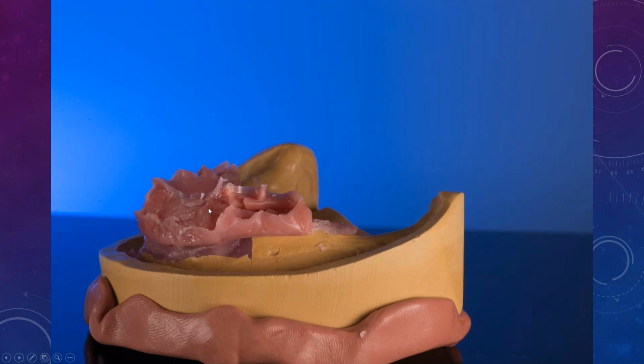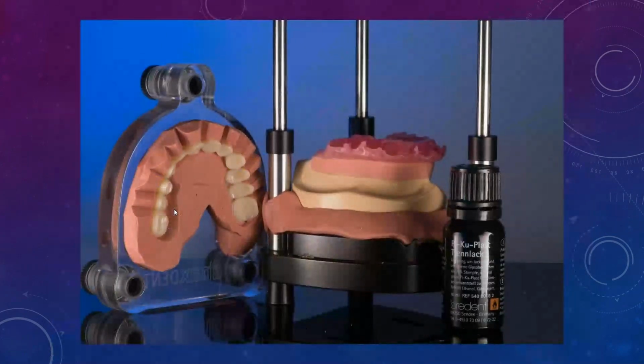But what happened in the beginning when I tried to pull it out, I didn't warm the wax enough, and ended up breaking the wax. If you want to use this method, make sure you get yourself a dehydrator. Put the denture in there, wax-up in there for like 10 minutes. It will soften up the wax enough to where you can remove the teeth and scan that portion. But there are easier ways to do this, guys. I used to use verticulators for the same purpose, and it was just a whole process. I would just reset the teeth back and use the wax and push it in place. It was just a nightmare as well, but it worked.